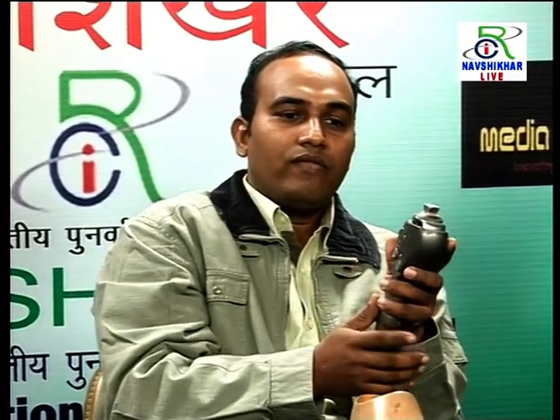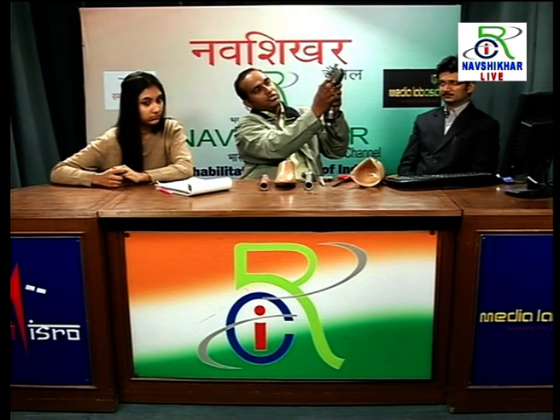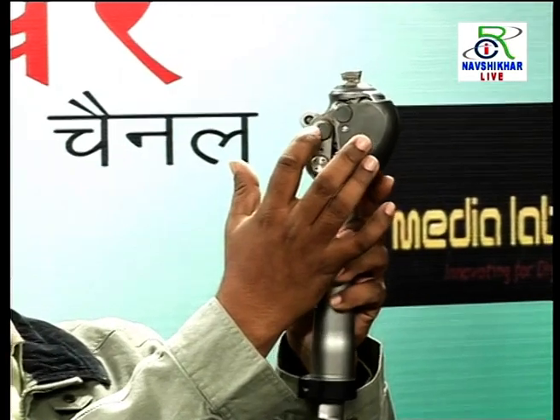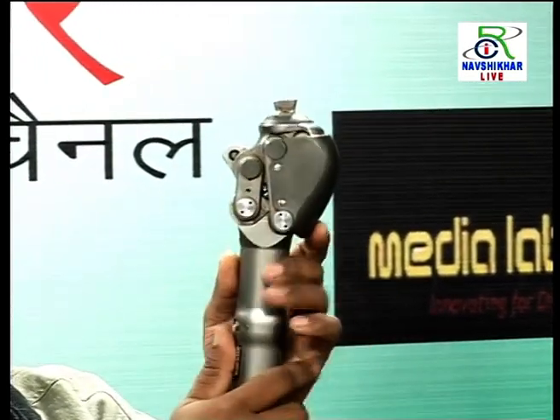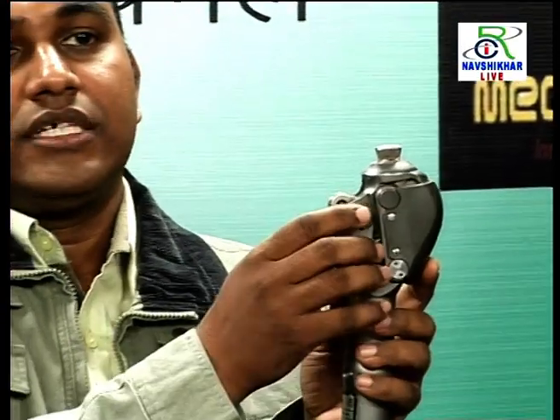If we describe the knee joint, it can be classified function-wise and linkage-wise. The common knee joint is a four bar linkage. Nowadays even very advanced knee joints are based on the common four bar linkage. 1, 2, 3, 4. If you see this, this is the four bar linkage knee joint. What is a four bar linkage? It is a linkage that gives you a movement.